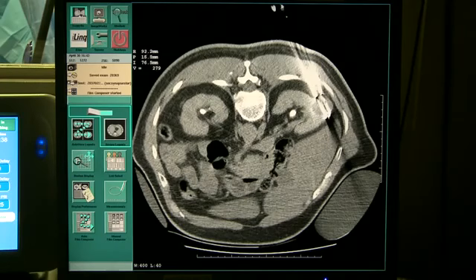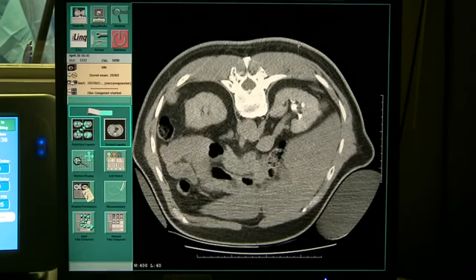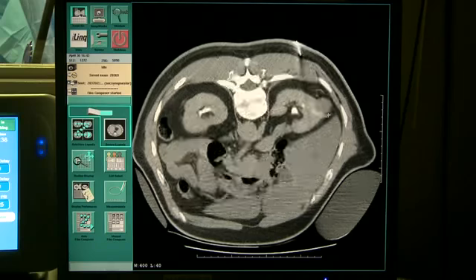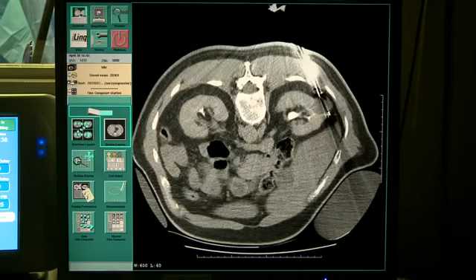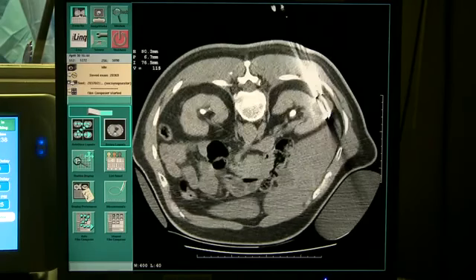That's partial volume. You know, CT will show things in the same plane. And as we continue up towards the top of the lesion, we've got our marker needle in place, and above that there's no tumor. So I think if we are able to put a probe here, we'll probably cover the whole lesion. The one part that I'm a little concerned about is the lower and medial aspect of this lesion.